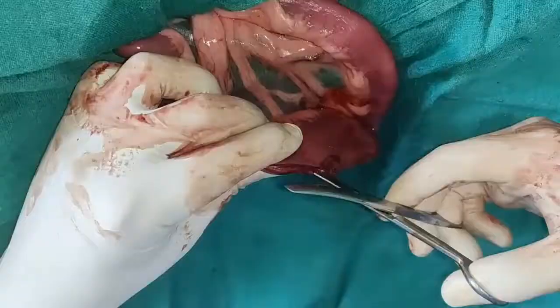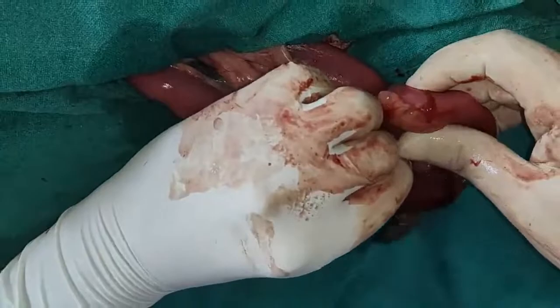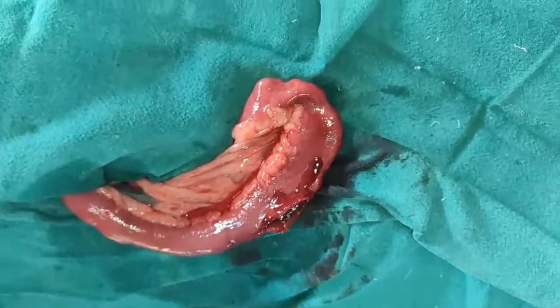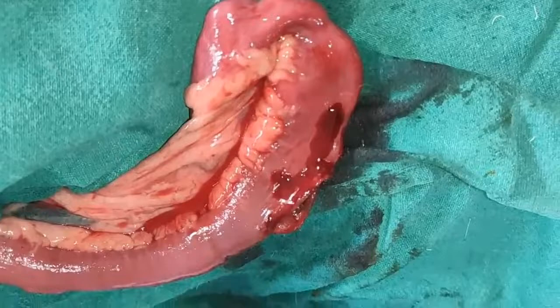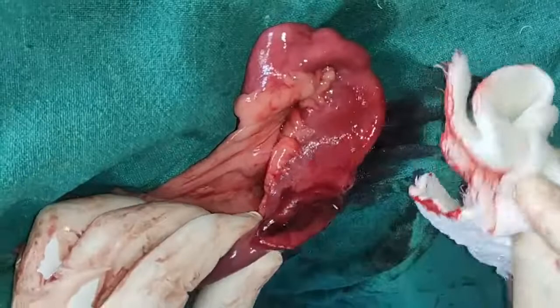Yeah, it must be the mango kernel. Now let's see what is coming. Okay, that's fine. If you notice properly, during the milking there was a tear. So probably nature also knows that if this moves, definitely there will be a tear over the anti-mesenteric wall of the intestine. That is why this foreign body has not moved.